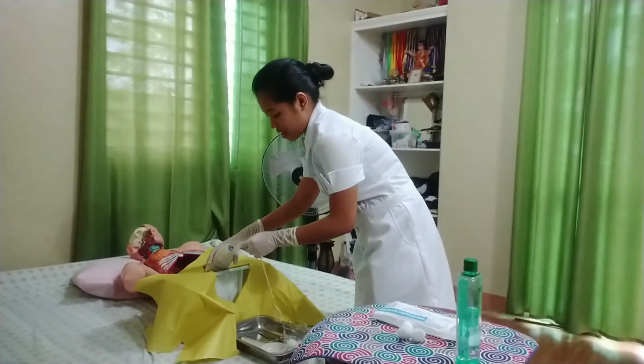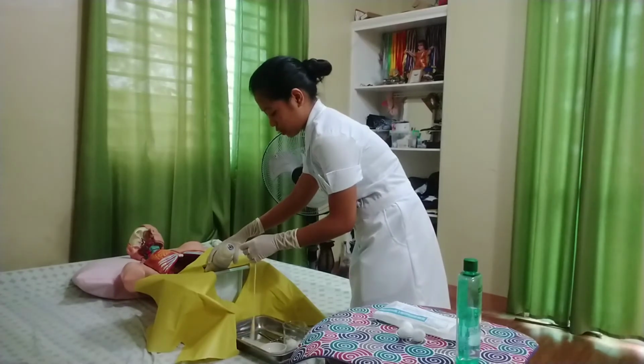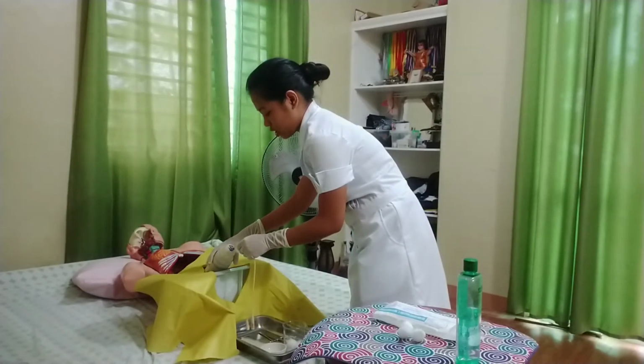I will advance it about 6 to 8 inches since it is an indwelling catheter. So take a deep breath, sir. And then we will rotate the catheter gently if slight resistance is encountered.